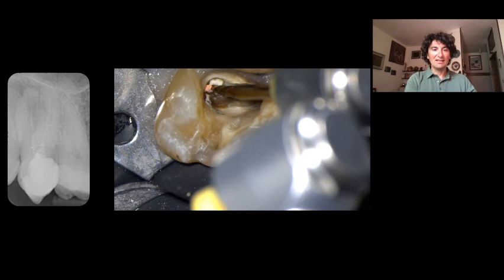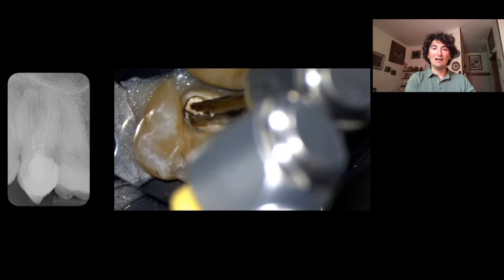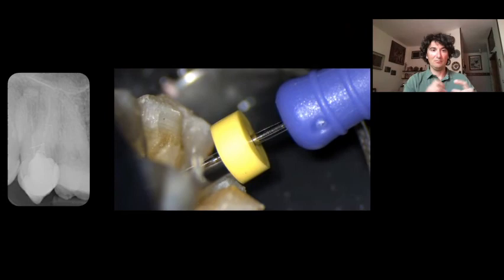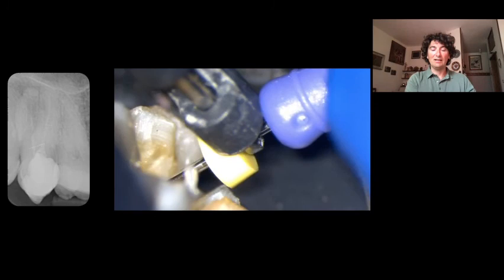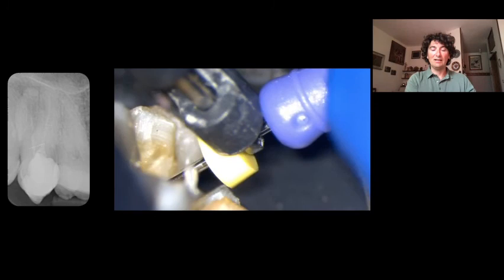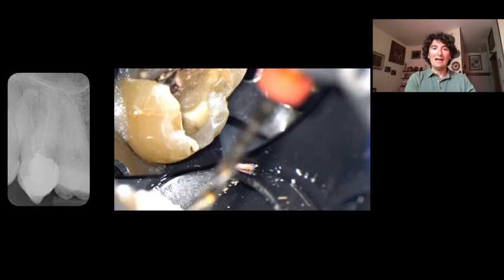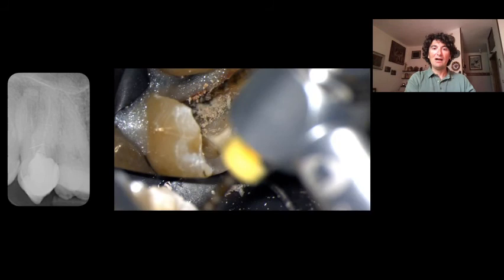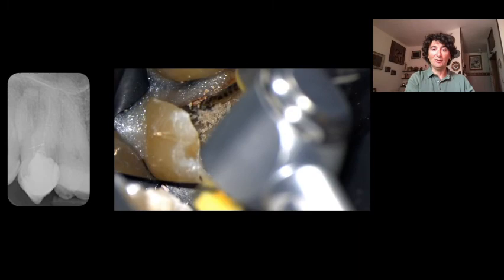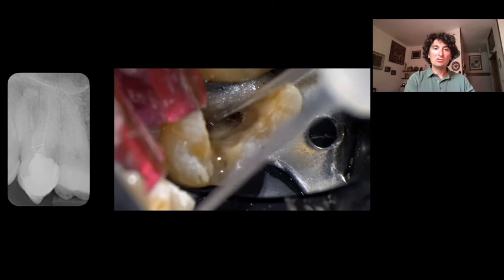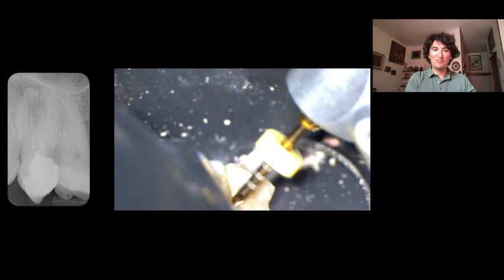It's not an easy case. But also this one — retreatment. Let me use the starter immediately: the starter is a beautiful file for starting a retreatment — you don't need to purchase dedicated retreatment files. After, you can use the 25-.06 in crown-down for removal of the coronal fill — it is a bit stiff but with good cutting efficacy. After, I take the working length. This is a demonstration that if we use a proper strategy, the same kit can be used for different purposes. Of course, I cannot use glide path files for retreatment because they don't cut anything — they can only break and cause an iatrogenic error. Now I took the working length, I am removing gutta-percha coronally, and I am using the 20-.04 for shaping at working length — doing crown-down also during retreatment.